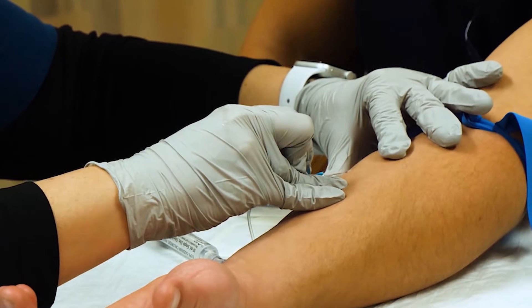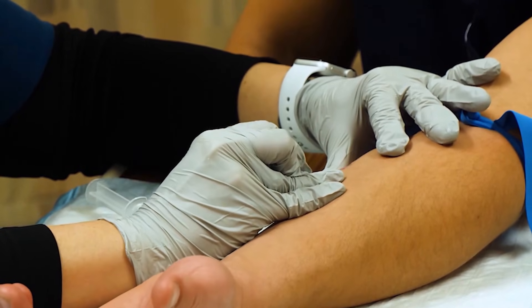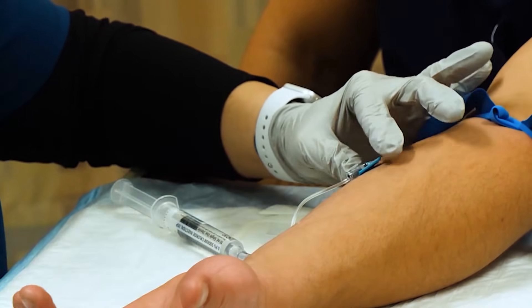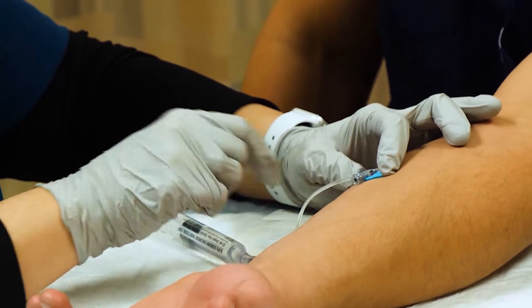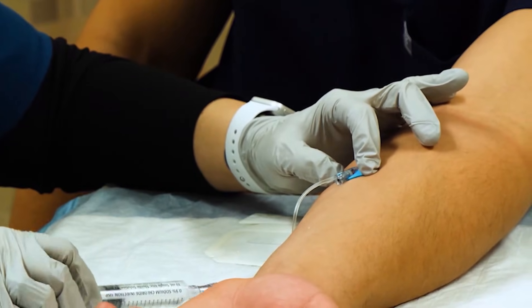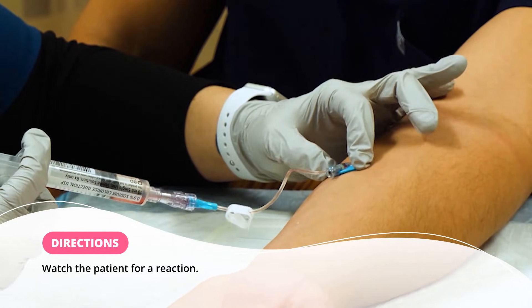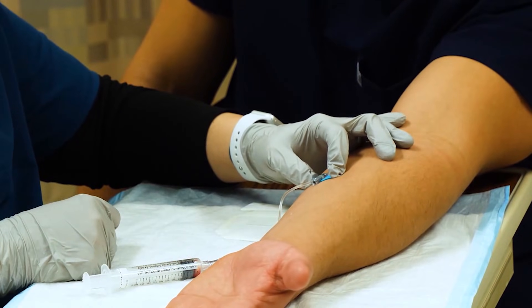Bevel up. Then I see blood, so I'm going to land my plane here and just ease it on in. Now I take this unit apart and release the tourniquet. I'm looking for a steady blood flow — you can see some blood here and a little blood here. Some have a larger flash so you can see a lot more blood. You can pull back and see blood in the tubing. Then flush it, make sure it doesn't hurt, make sure it doesn't poke up, and make sure the skin doesn't look bruised. You can actually feel the coolness of the saline flush going through the vein — sometimes you can taste it. The whole time, keep it stable so it doesn't move.